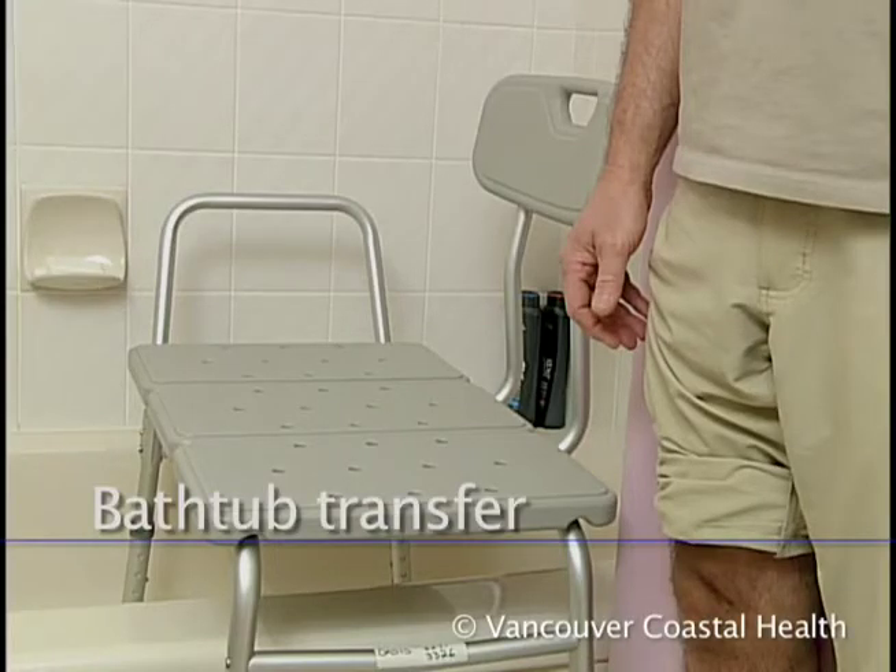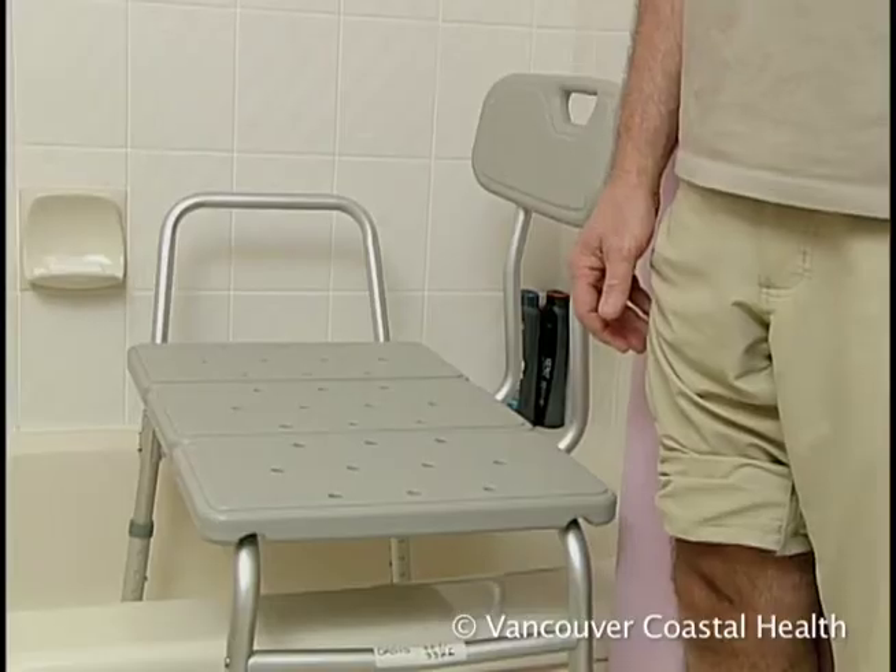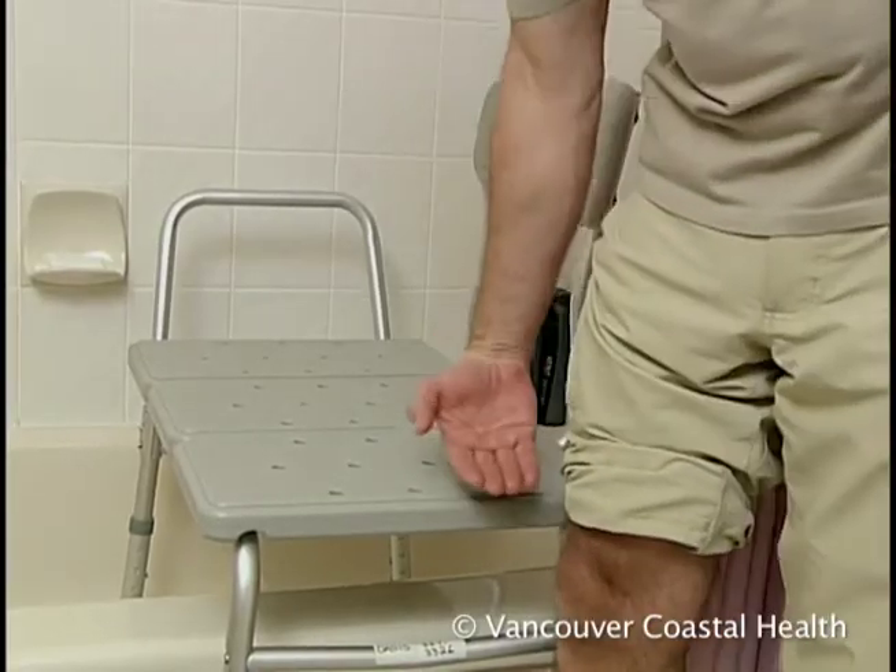Use a tub transfer bench to get in and out of the bathtub. Two legs of the bench are in the tub and two are outside. Adjust it so that it is two inches above your knee height.